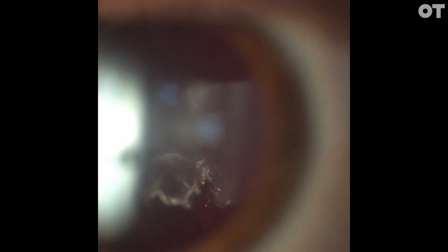It's important to do what we call dynamic examination, and that's where you get the patient to move the vitreous and to look down and then quickly look straight ahead. The purpose of this is to move any cells or tobacco dust that may have settled in the inferior vitreous into your field of view.